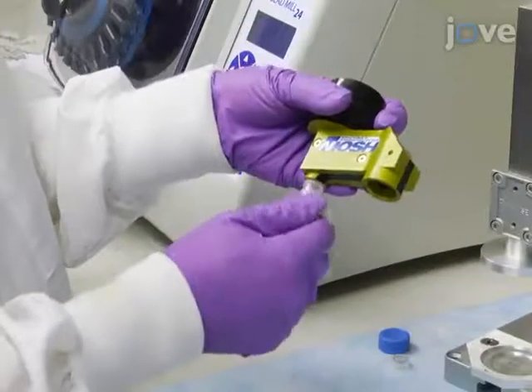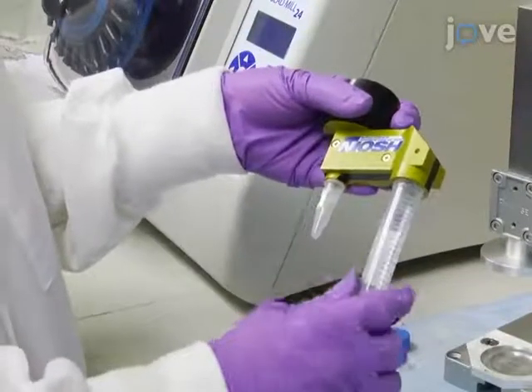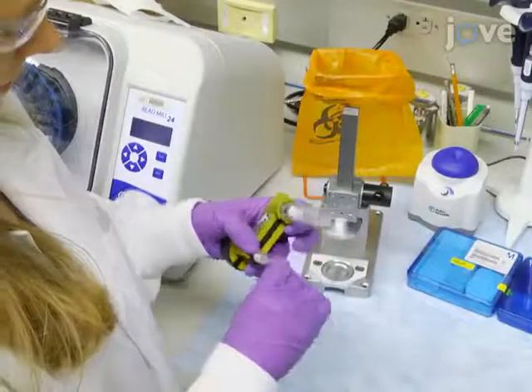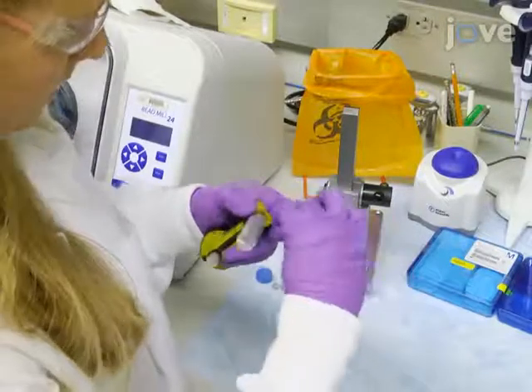Screw the collection tubes tightly and fully into the sampler until they bottom out, and wrap the sealing tape around the tubes acting as a secondary seal against leakage.